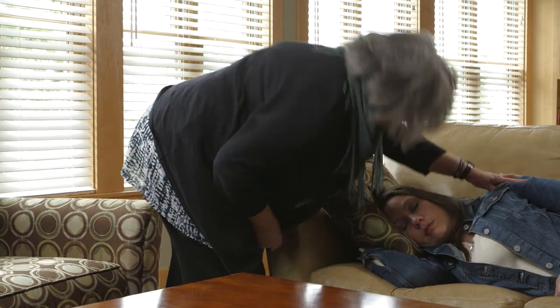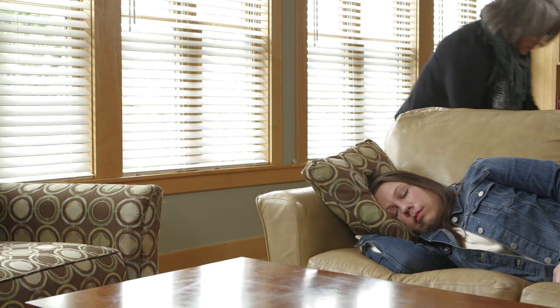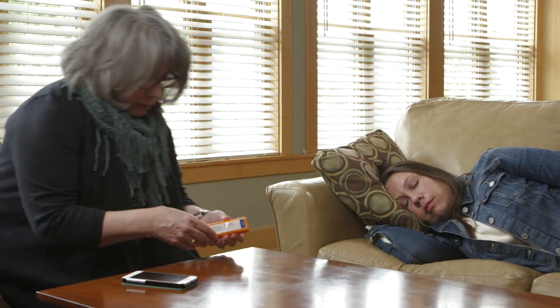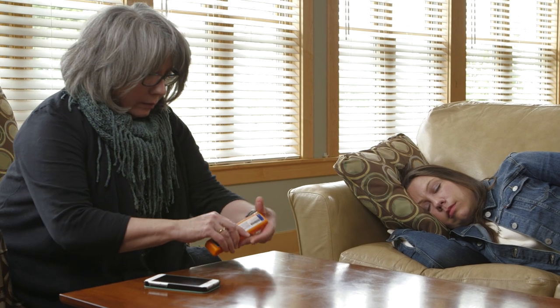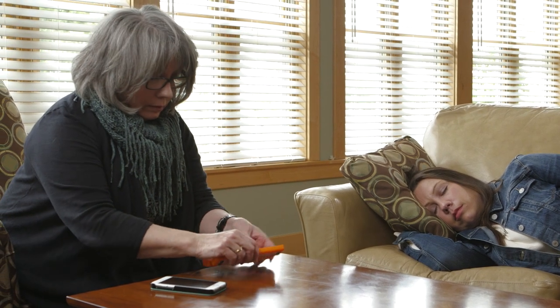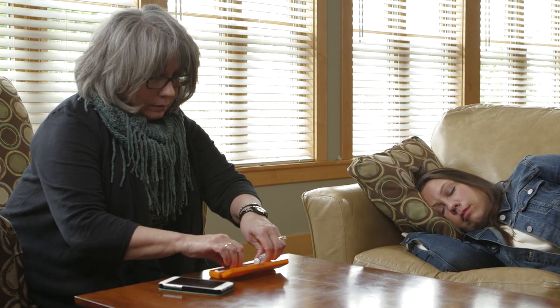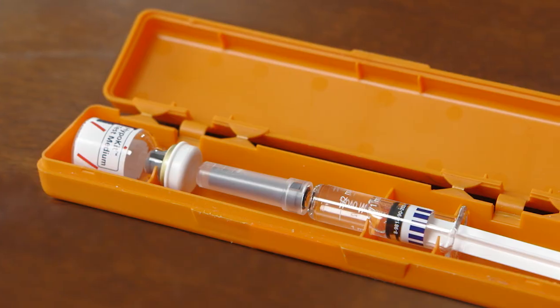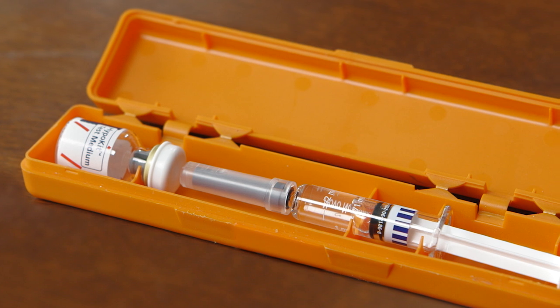When your child has severe low blood glucose, you will need to act quickly. This step-by-step guide on how to use the glucagon emergency kit will help you should the need arise. It's important to be familiar with this kit and how to use it before an event takes place.